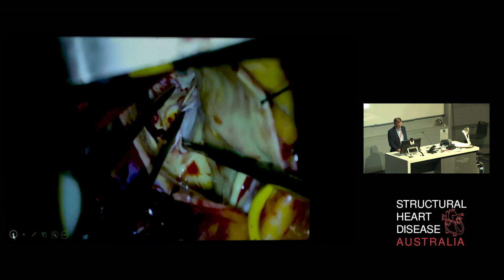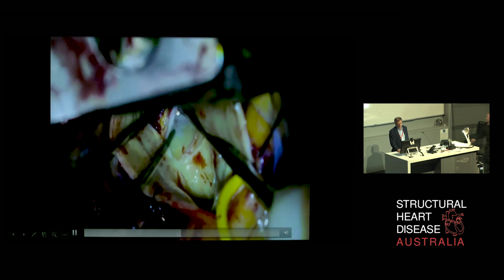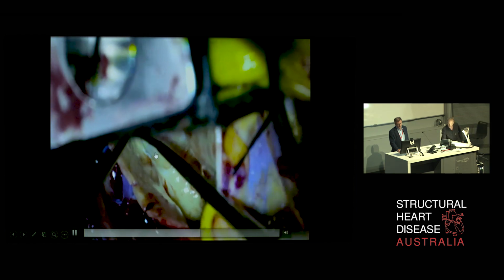So that's where we need to be. It's a trick, isn't it? Yeah. You turn the sound. Yeah, there you go. That's it. That's the plane. So that's raising the endarterectomy plane there.